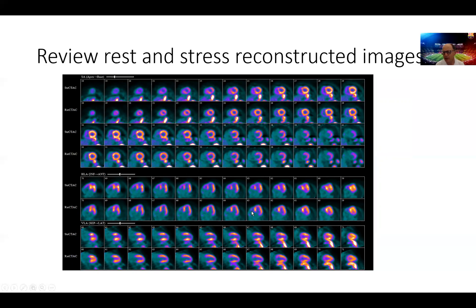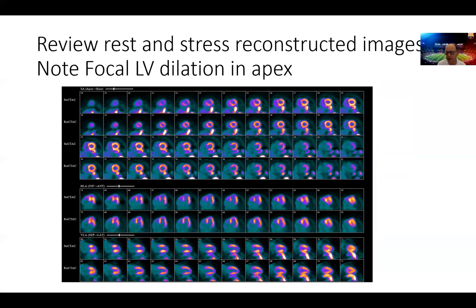One more thing here, we notice there is increased RV uptake from the rest of the stress images. So on the rest images here, you have minimal RV uptake. On the stress images, we have enhanced RV uptake.